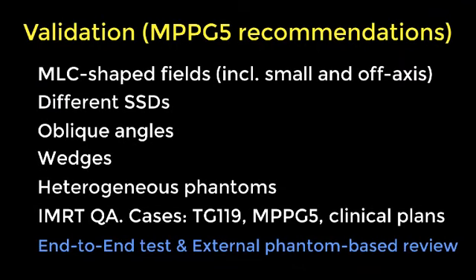So at this point, I would like to share a little bit of the community experience and data around these external phantom-based validation tests. Let's look at this list from MPPG5. So it's a long list of validation tests, and at the very end is this external phantom-based review. So one might question the value of that, given that there are so many validation tests done before that. What really is the point of this external phantom-based test? So I'd like to share a story with you around that.